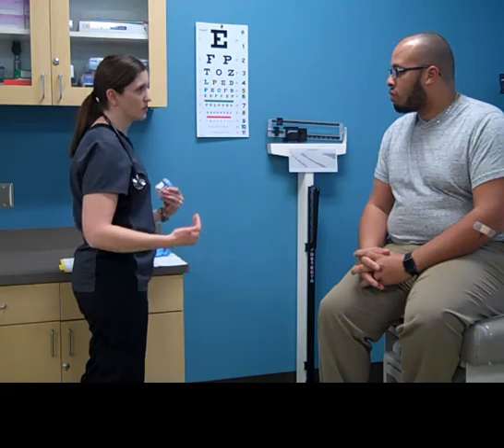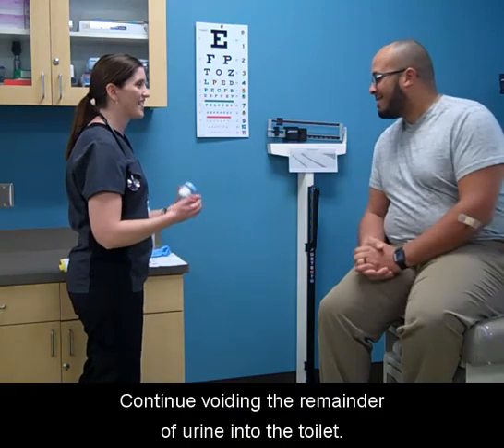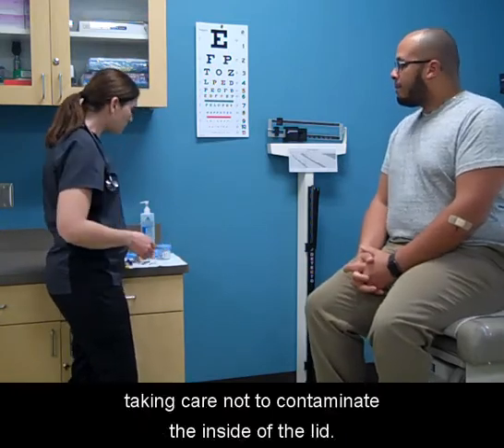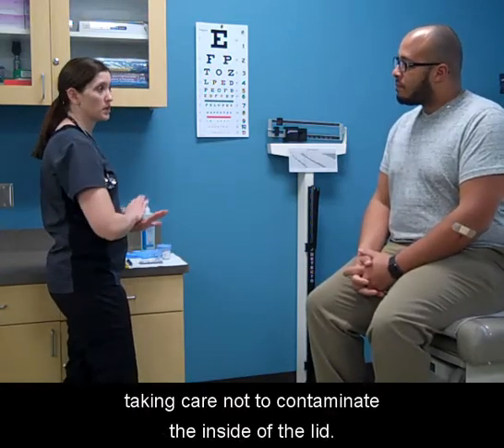Remove the container. Continue voiding the remainder of urine into the toilet. Recap the container immediately, taking care not to contaminate the inside of the lid.